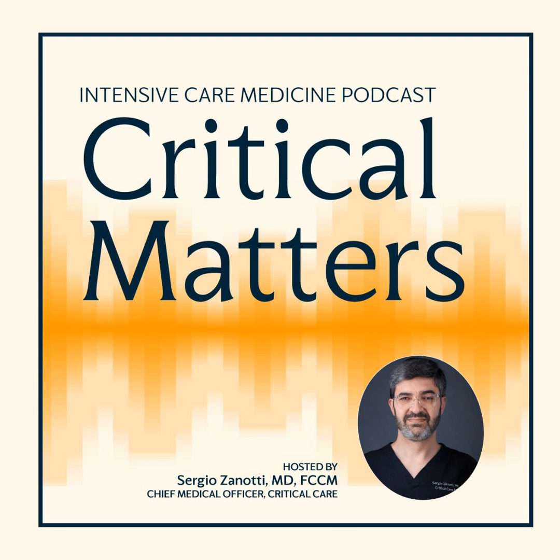So that's essential. The second thing I do is I only let the most senior experienced person with ultrasound do the ultrasound. This is not a time for the medical student to learn how to do a couple views. This is not a time for the resident who's done a little bit of ultrasound. I need the fastest person to get on the chest, to get some answers, and then get right back off the chest so that we can do chest compressions. So that's tip number 2.